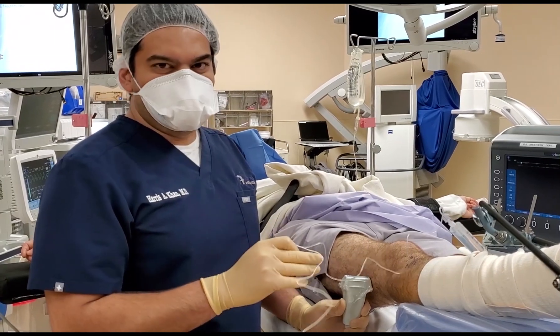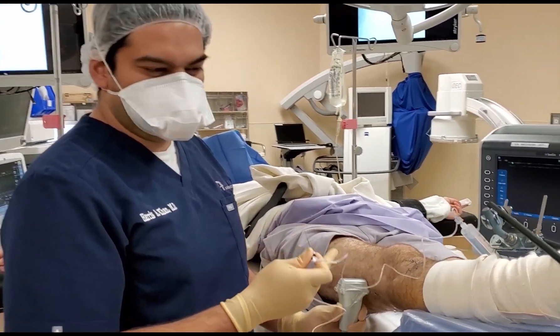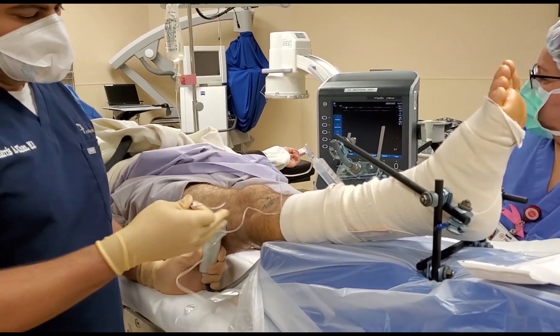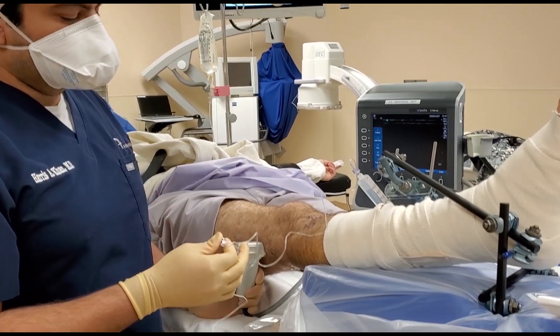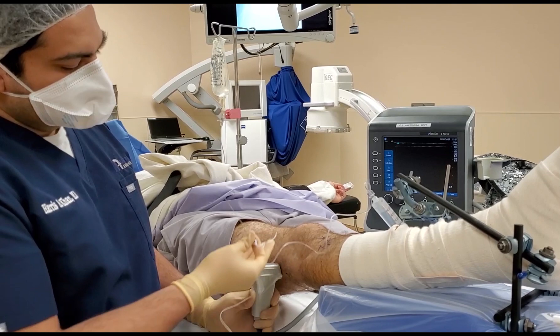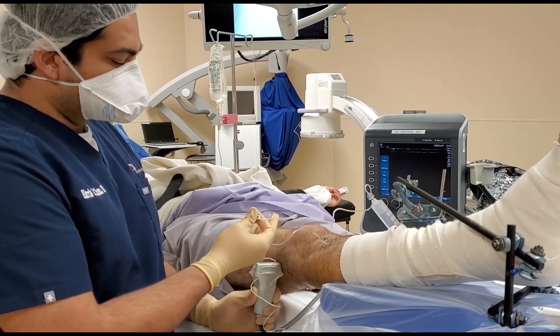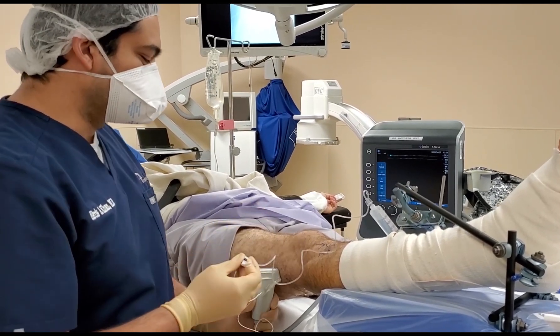The most important thing about this block is really setting yourself up for success. Have the table at a height that's comfortable for you. Use this bone foam with the tapered end away, having the foot rest on the bone foam. I like doing it this way because I can slide my ultrasound probe on the posterior part of the knee and use the weight of the knee to ensure good contact with the ultrasound, which really produces a great image.